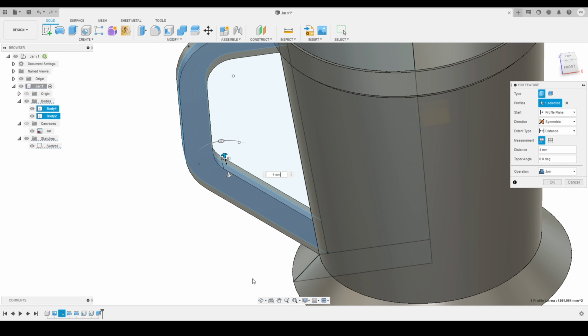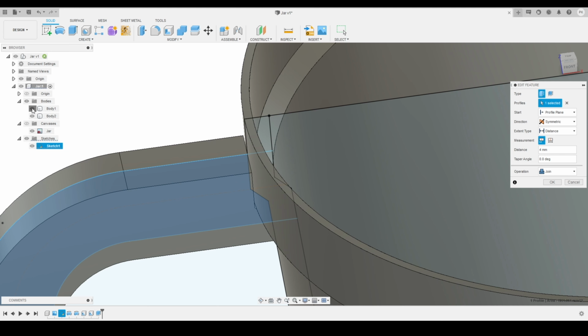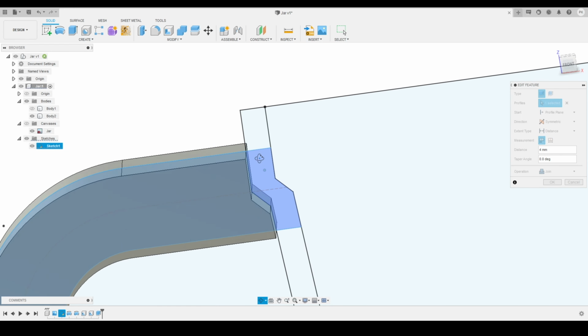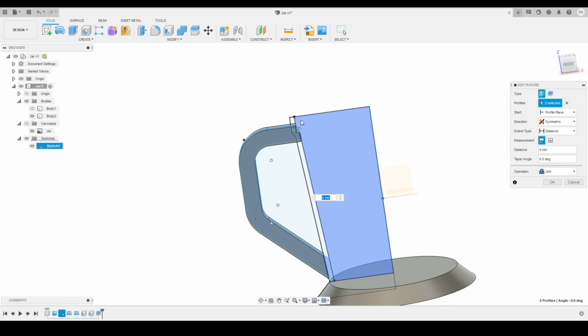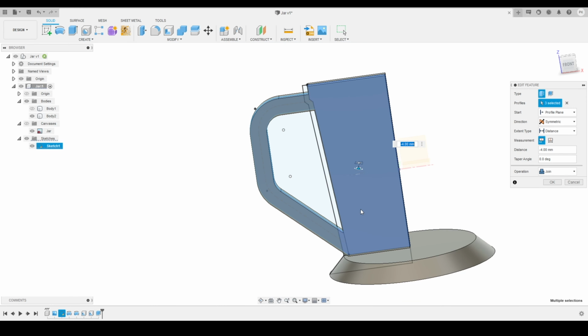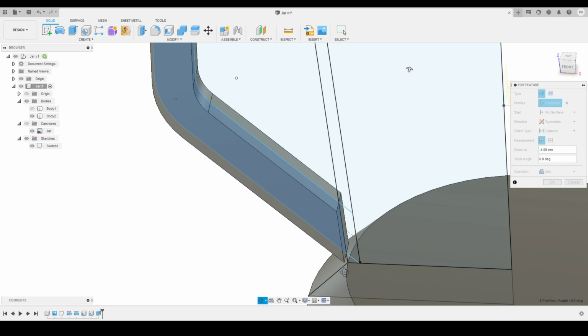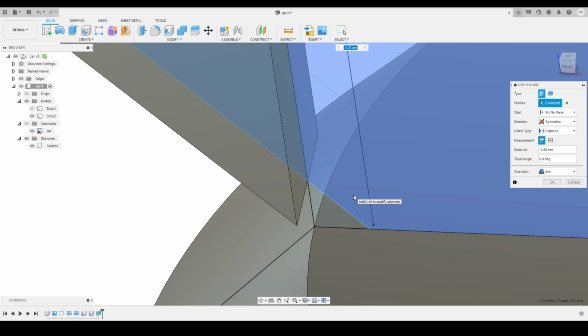So I will go to the extrude profile and double click to edit that profile, and add a few more profiles over here. Here you can see these are the profiles I just missed, so I will select them to add those profiles. At the bottom here you can see that once I select this profile, the complete loop is getting selected. So I think there is some problem with the profile, so I will cancel this for now.